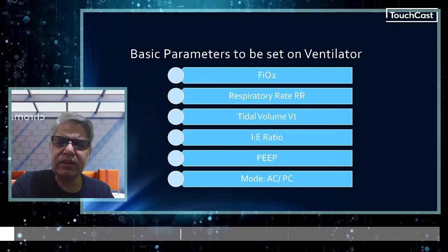But sometimes in certain conditions in which there is excessive accumulation of air inside the lungs, like expiratory pathologies like in acute severe asthma, where the child is not able to properly exhale and there's air trapping inside the lung, we usually go for a higher IE ratio. So we can have a 1 to 3, maybe sometimes 1 to 4, and in severe cases even a 1 to 5 ratio, inspiratory to expiratory ratio. But nevertheless, if there is no air entrapment based on your lung x-ray, you can go for a 1 to 2 ratio.